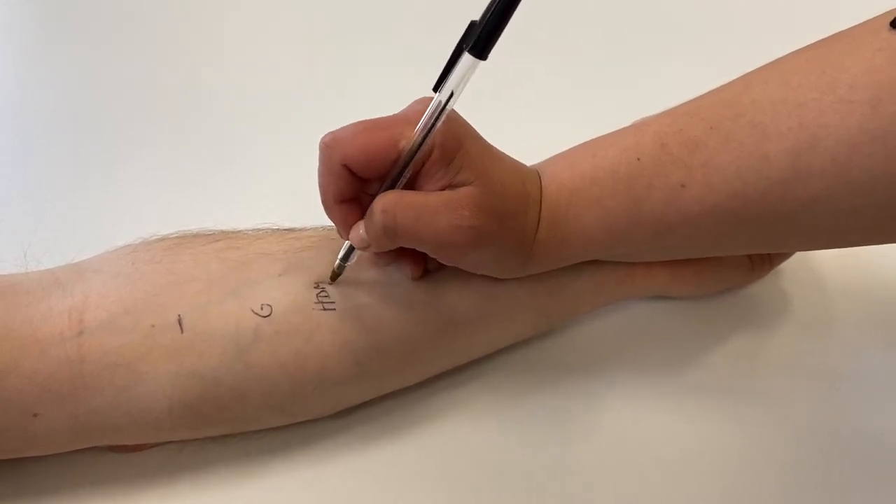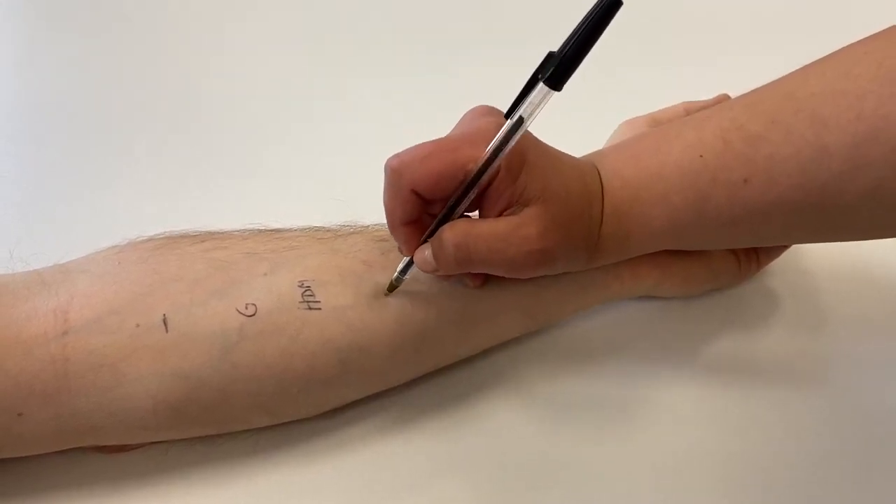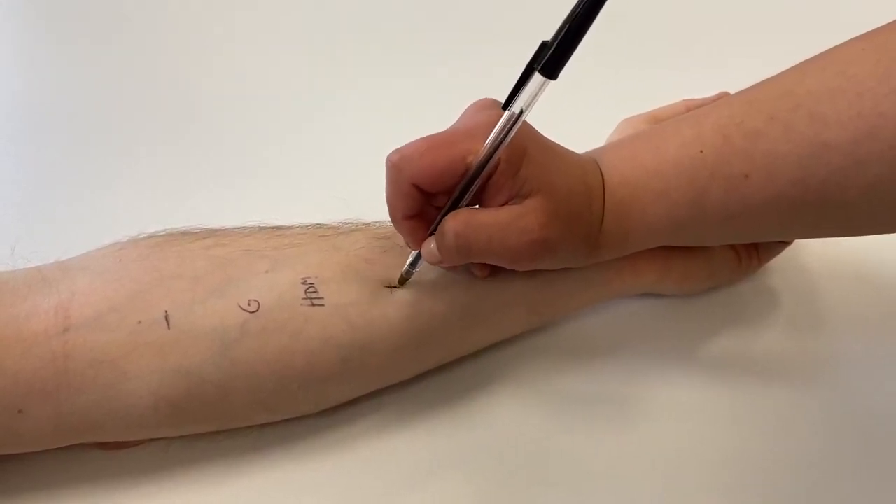It's important to keep a decent distance of at least one centimetre, if not more, between skin prick test drops to avoid cross-contamination.